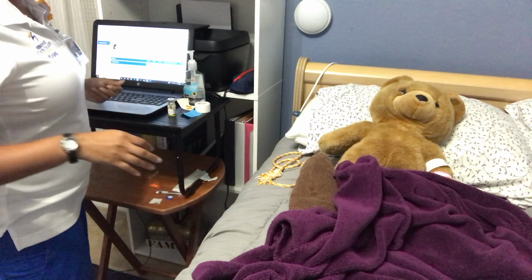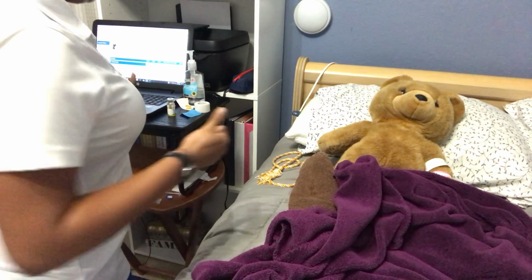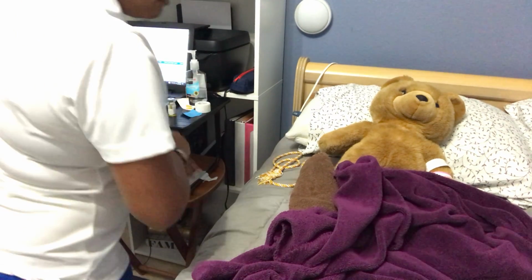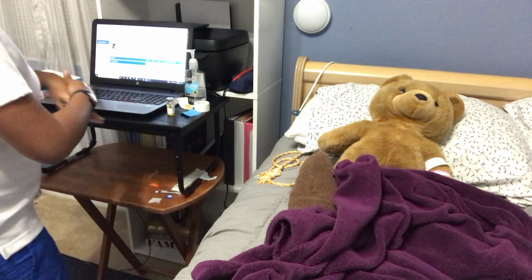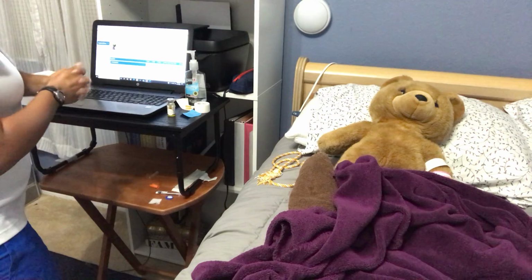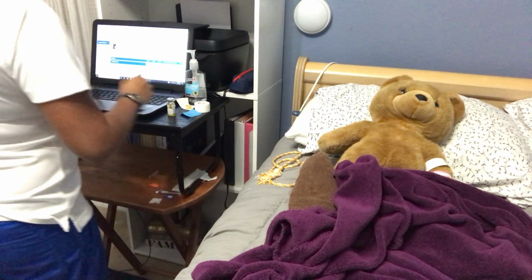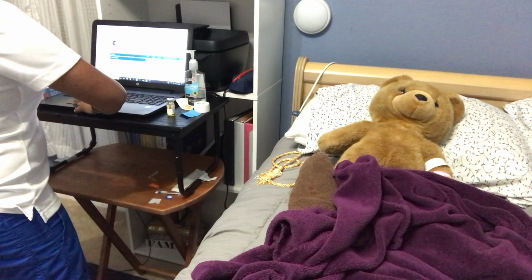Alright, Mr. Simpson, how are you feeling? I feel okay. You feel good? Okay. So what we're going to do is I'm going to clean my hands. Assess the location. Alright. The next thing I'm going to do, now that I've cleaned my hands and the medication is in, is document the medication.